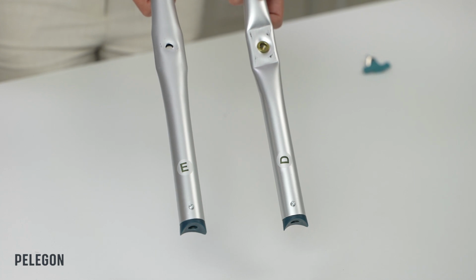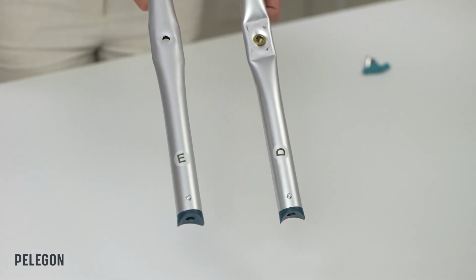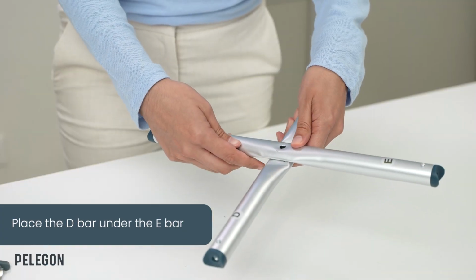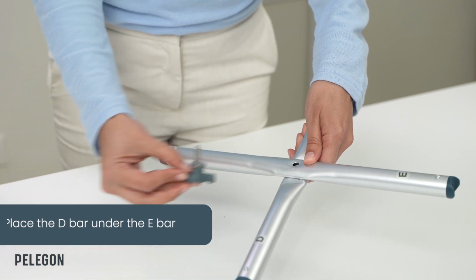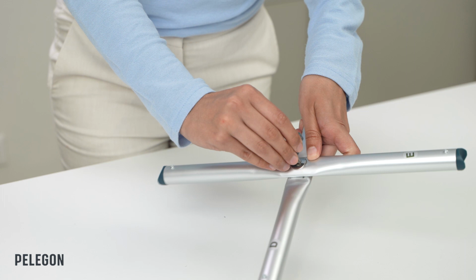Next, let us connect the crossbar using the 2 straight bars, labeled D and E. Place the D bar under the E bar, and be sure to place the screw through the E bar first, until its edge comes through the D bar.